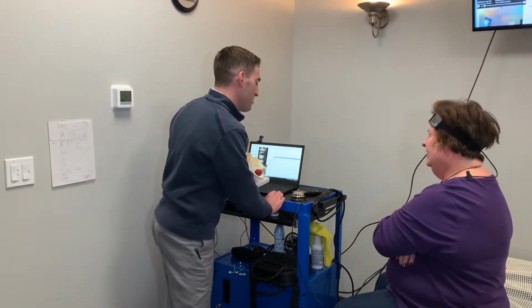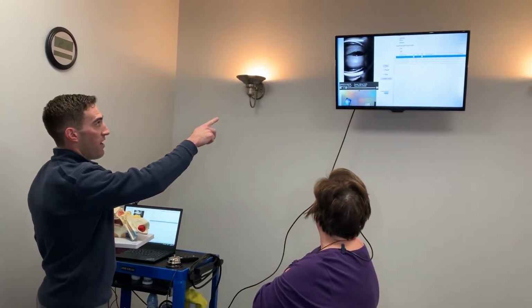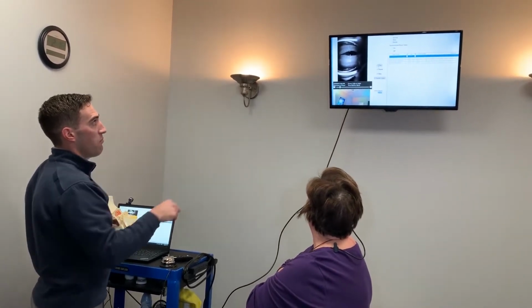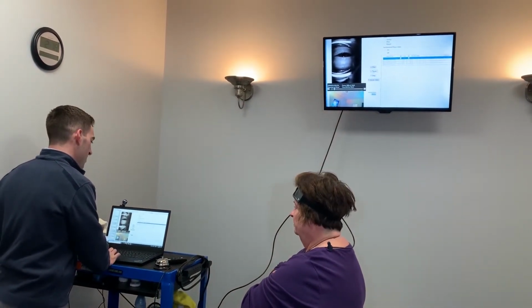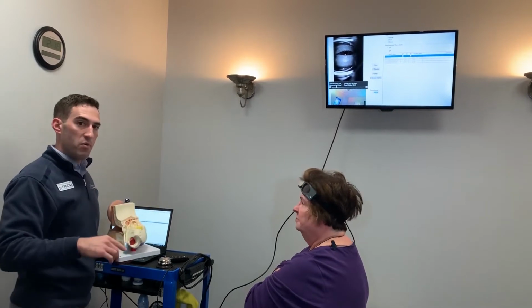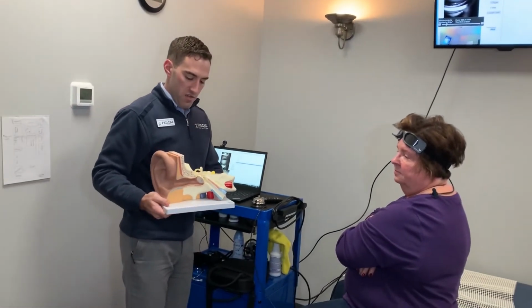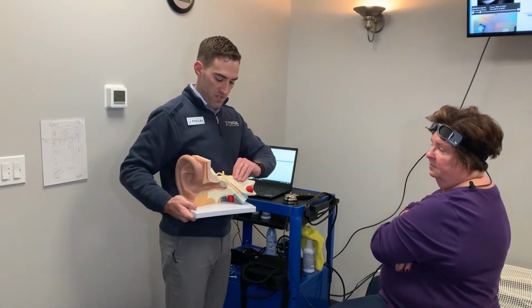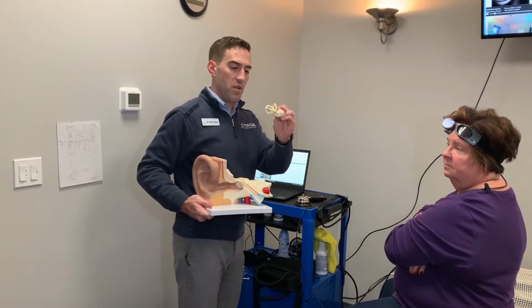So what we found, she's been coming here for a little while and her vertigo is changing, but I'm going to show on the video up there where her eye is moving in an upward direction. And she's seen this before, but what that means, and we'll show it more in a second when we do a maneuver to correct this, is in her inner ear she has this little center called a vestibular center, or it's an area that measures our balance and where all of that comes from.